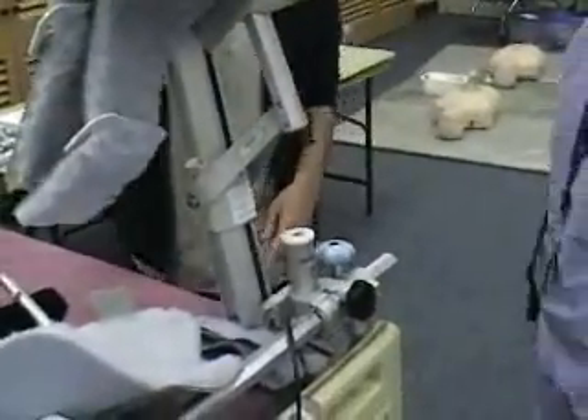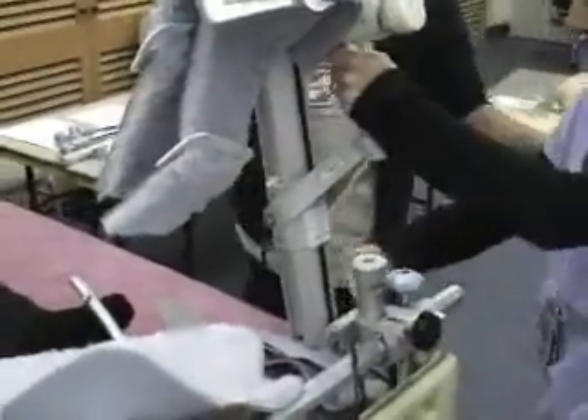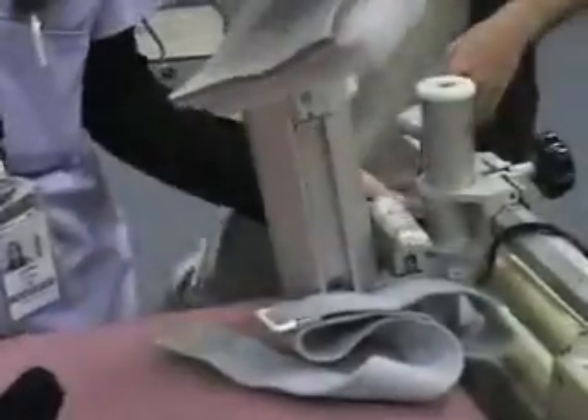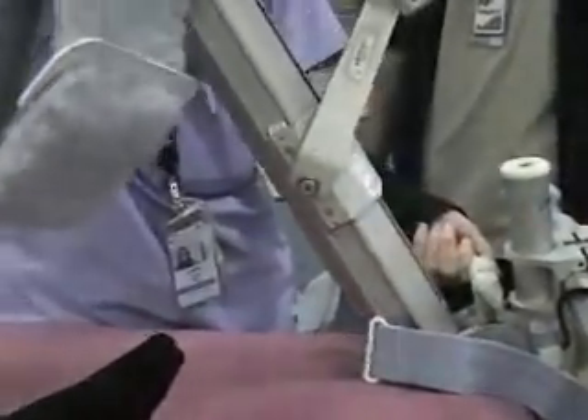We're going to place the CPM onto the patient. You might want to stand right here and support it. Turn that knob counterclockwise to unlock it — so we're going to turn this way — and then take the CPM down.